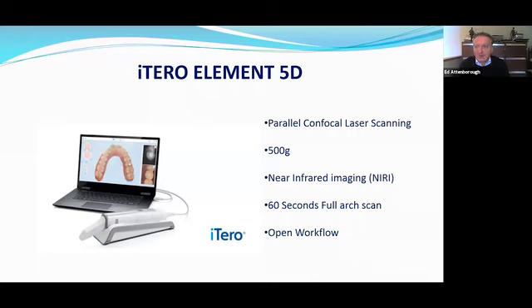Remember that we have to do both arches and a buccal bite scan as well. So typically a scanning session will take around 2.5 minutes, which I think is comparable to taking a classic impression, upper and lower, and a wax bite.